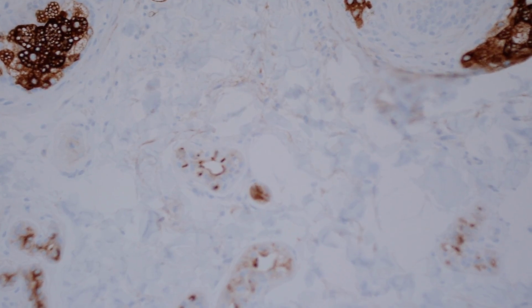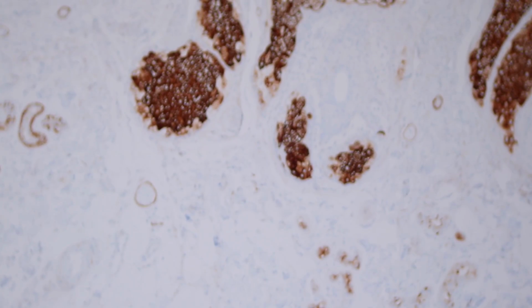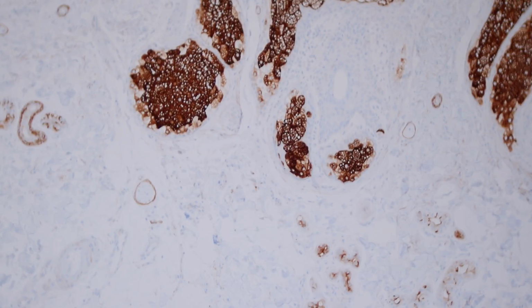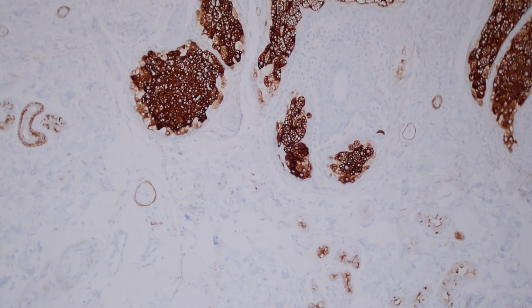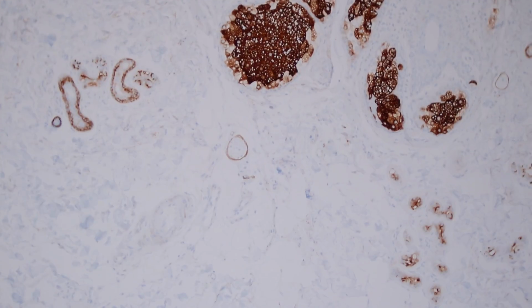And then one other structure you can use, and I find that when I'm looking in, say, soft tissue, and I want to use EMA for a soft tissue tumor, and I don't have any epidermis present, one nice internal control that you can use are nerves, because nerves are surrounded by a layer of perineurium, and perineurium is positive for EMA. So here is EMA beautifully staining this layer of perineurium, and the inner Schwann cells and axons, those are all negative, but the perineurium is positive.